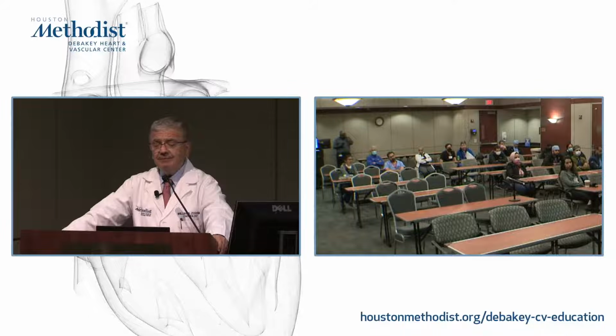I think from experience and from data, it is not an effect on the myocardium. It is either an overestimation or a different visualization. Hard to tell. But I think it's realistic that what you see with contrast, provided it's not foreshortened, et cetera, is that you get the images correctly.